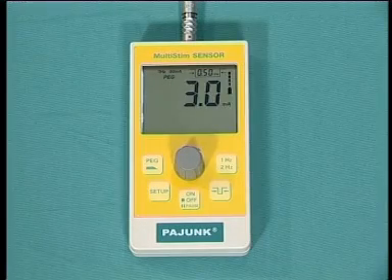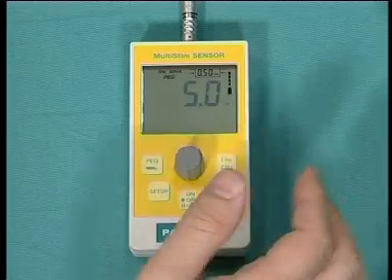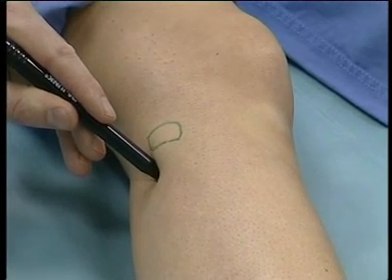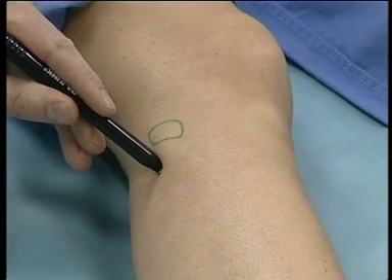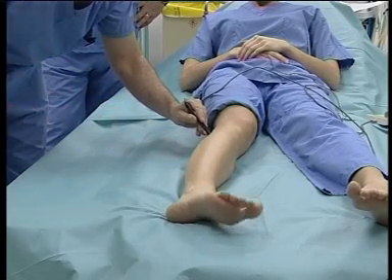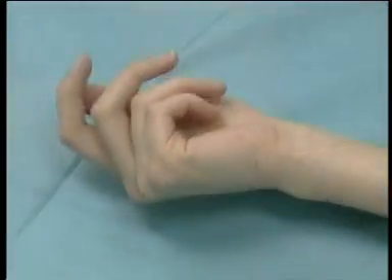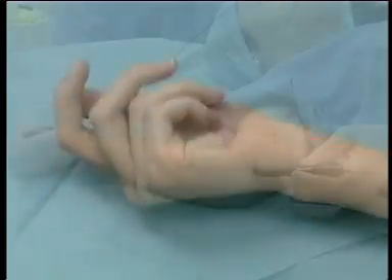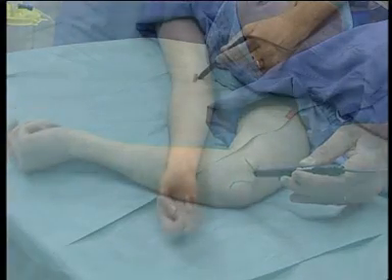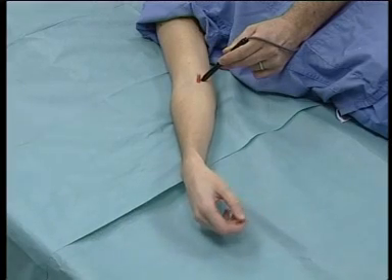We suggest commencing at a current of 3mA for upper limb blocks. For lower limb blocks, the current is commenced at 5mA. To locate most of the peripheral nerves, only light pressure need be applied to the skin surface, to which has been applied a water-based lubricant. The peg is moved over the skin surface until paraesthesia or a motor response is elicited. Transcutaneous electrical stimulation to elicit motor or sensory response is used to assist identification on the skin for needle insertion during peripheral nerve blockade. Pre-location of the nerve could therefore be useful in reducing pain, as the procedure reduces exploration time with the needle and improves precise location of nerve position during the block.